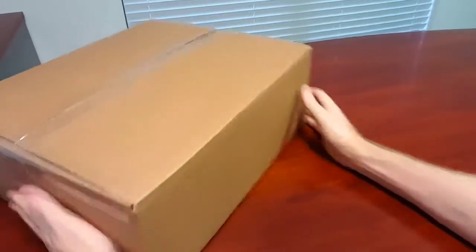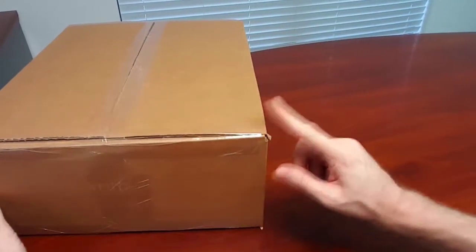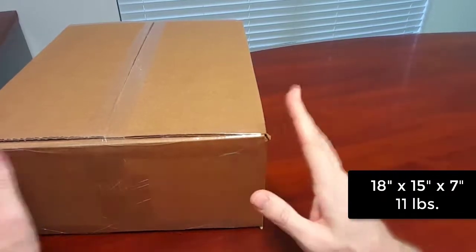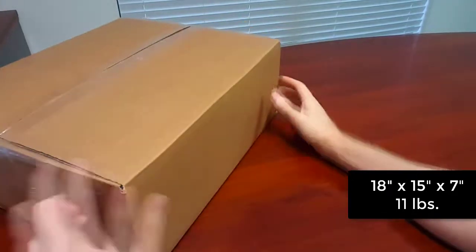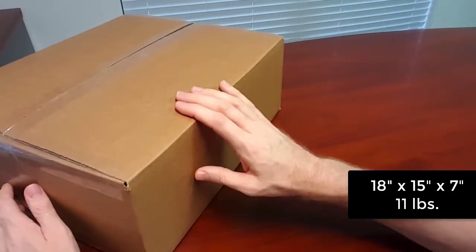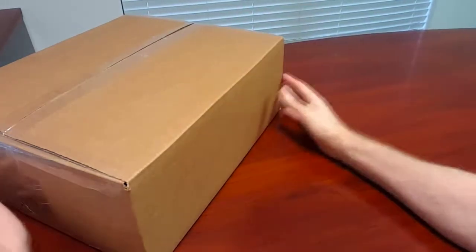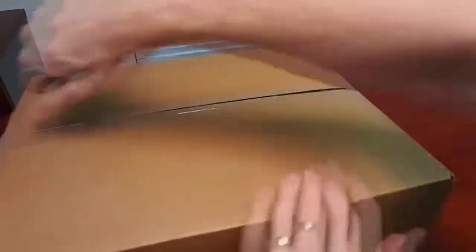Just to summarize, this is the entire system. It comes in a single box that weighs 11 pounds, and the size is basically 18 inches by 15 by 7 deep. It's sent anywhere in the United States second day air. So let's go ahead and open this up and see what's inside.